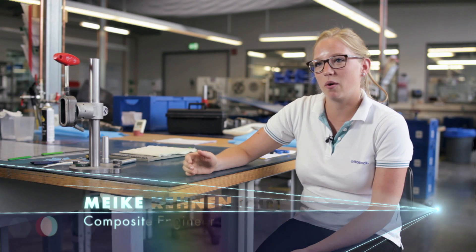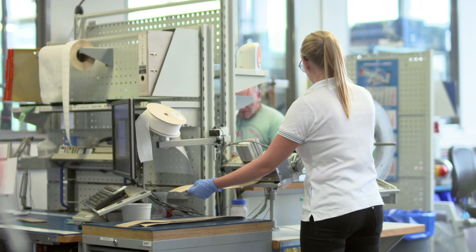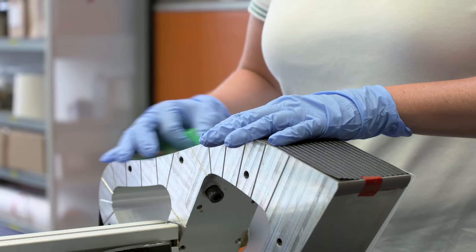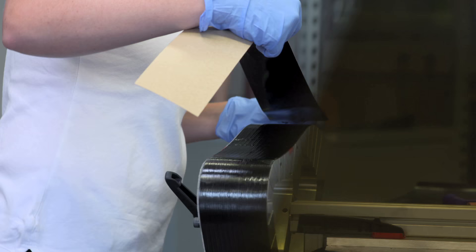The first step of the process is to prepare all the materials and then cut all the layers of carbon fiber. The next step is the layering process, where the worker has to lay up each layer on the mold. There are about 60 layers, so it's really a lot.